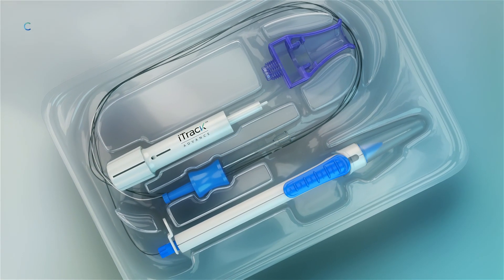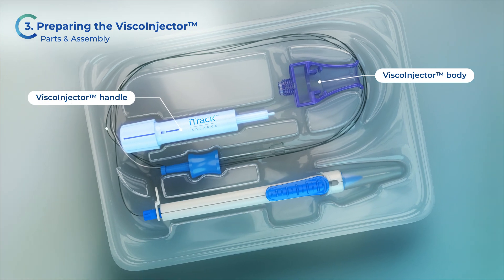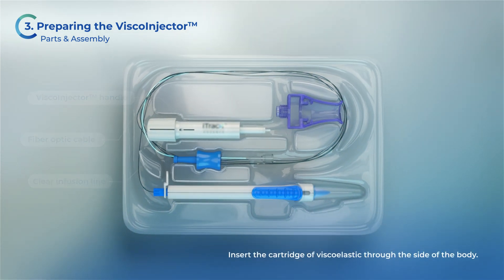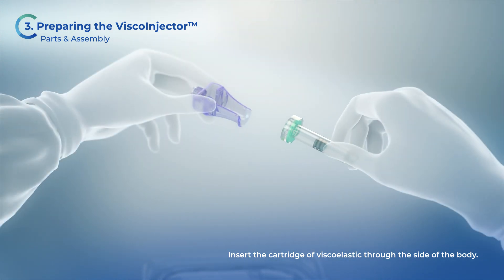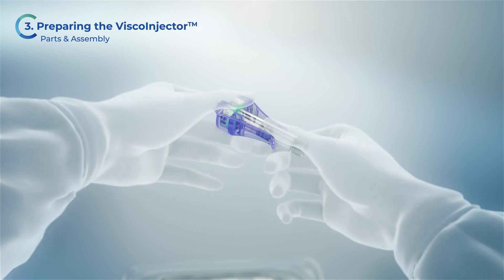Inside the tray you will find the VSCO injector body, the VSCO injector handle, the black fibre optic cable, and the clear infusion line. Insert the cartridge of viscoelastic through the side of the body. You will hear an audible click as the cartridge is properly inserted.